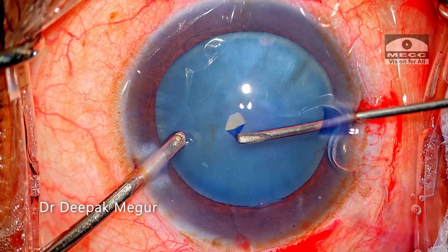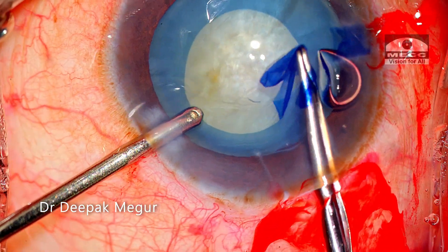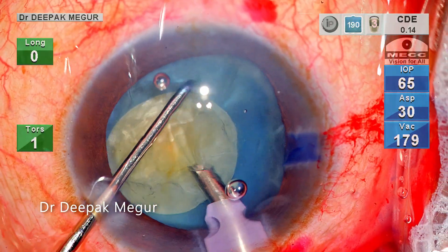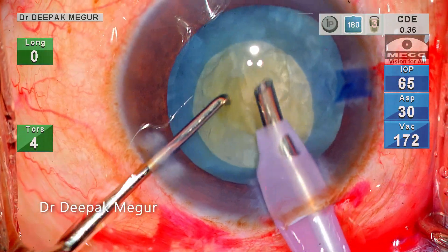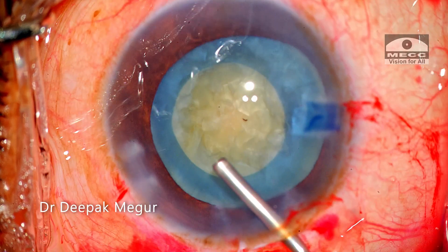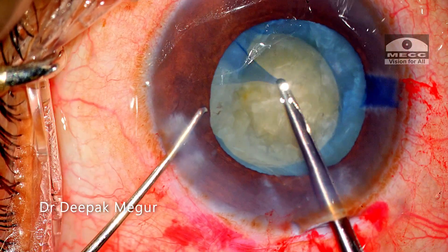My plan is to do the two-stage rhexis. The primary rhexis is done and I'm trying to decompress the bag by aspirating the cortex in front and behind the nucleus with my phaco tip. I thought this much decompression was good enough, and I proceed by giving a tangential cut to the rhexis margin and trying to enlarge the rhexis. It just runs to the equator.